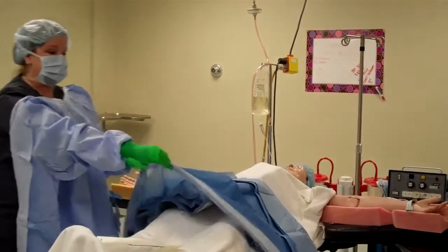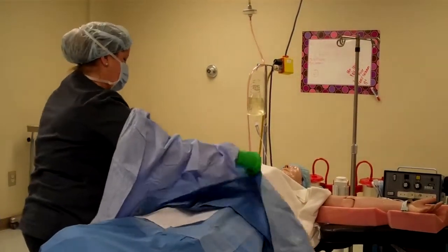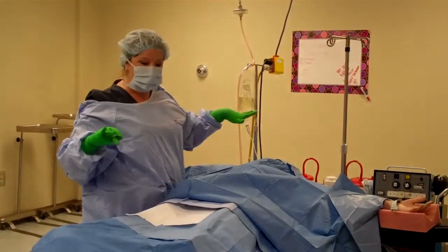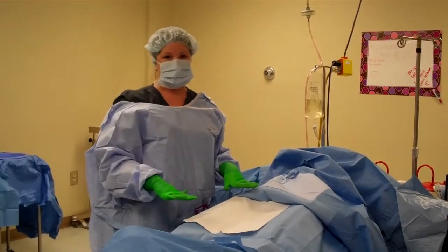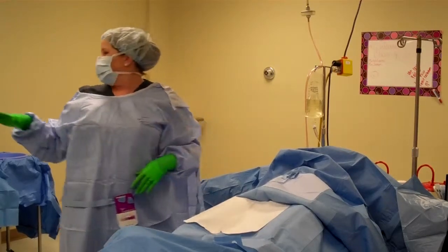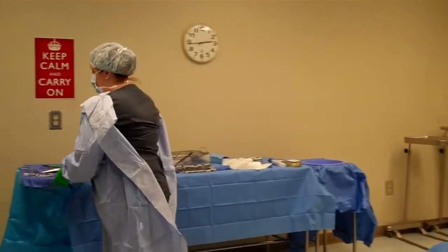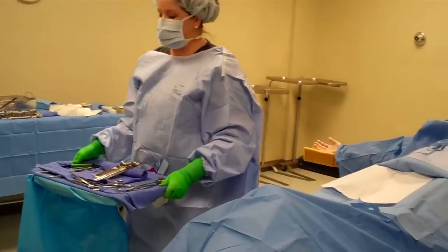Usually I have another person with me doing this, but this is just to give an example. Anesthesia will grab this and hook it up to the IV poles at the top. Now, once this patient is blue, covered in blue, you do not touch anywhere around the patient or the table or the Mayo stand. Okay? This, once I have draped, I will place this over my patient.